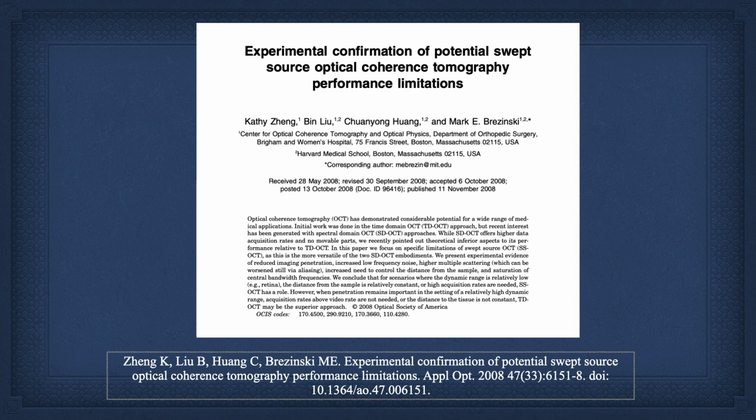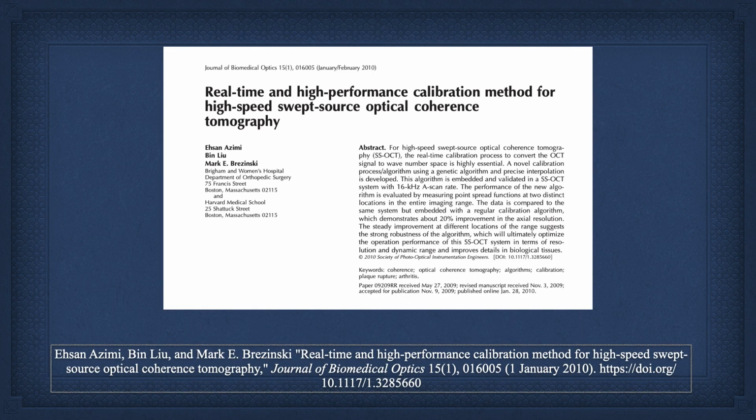We went through, and you saw the scaffolding one where we compared the modalities head to head. Finally, and we patented this, we developed a calibration system between the sweeping and the processing at the A to D converter. We put in a MZI clock.